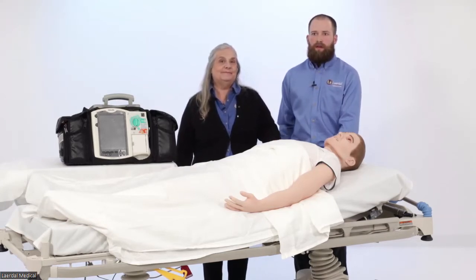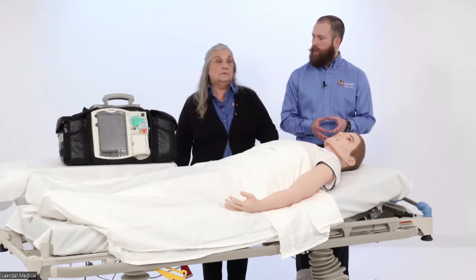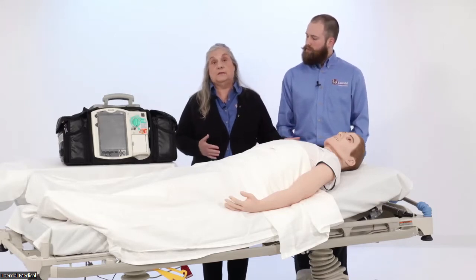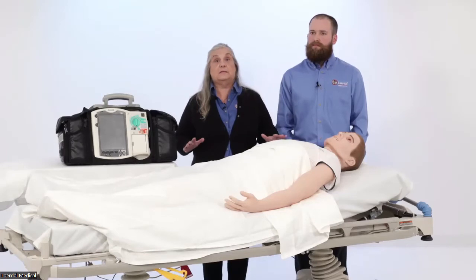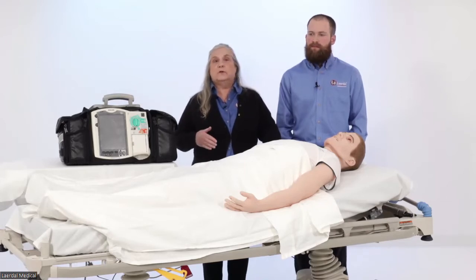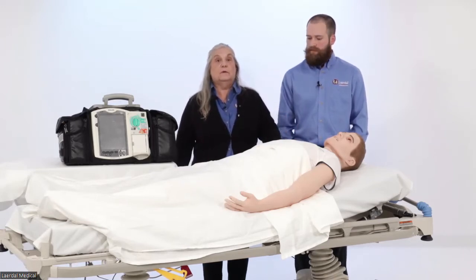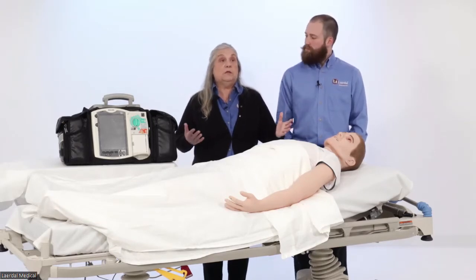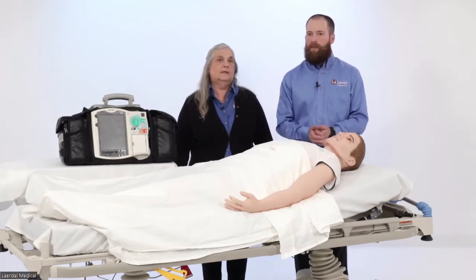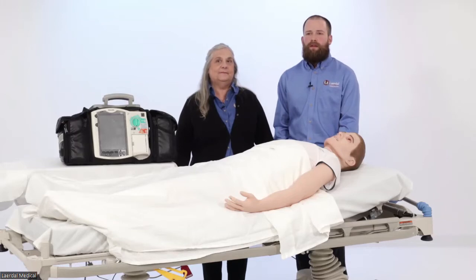Yeah, absolutely. Okay. Another question that came in is regarding patient monitors. So what patient monitors are compatible with the SimMan 3G Plus? Well, pretty much any all-in-one monitor that we've had in the past for our SimMan series or our other mannequins will work. But you can also, if you have the Vitals Bridge, use your regular OR monitor or your regular med-surg monitor right on the floor and use that to run simulations with the mannequins. So either way, you can use them. Yeah, and we're proud to partner with Dynesthetics on the Vitals Bridge product as well. We have a couple of different versions and cable sets, but pretty much any of your clinical monitors, it goes right up to it. Excellent.